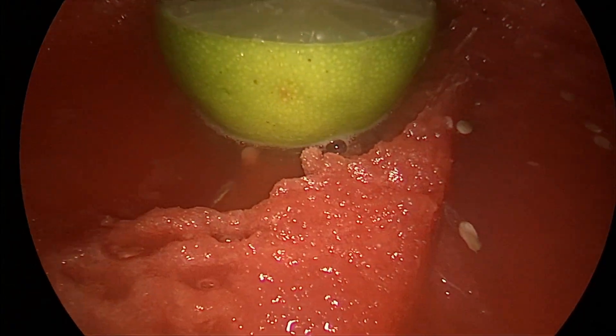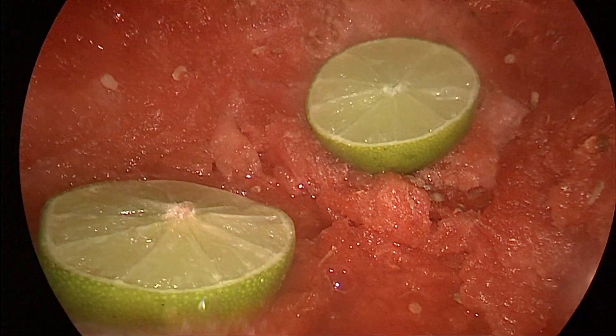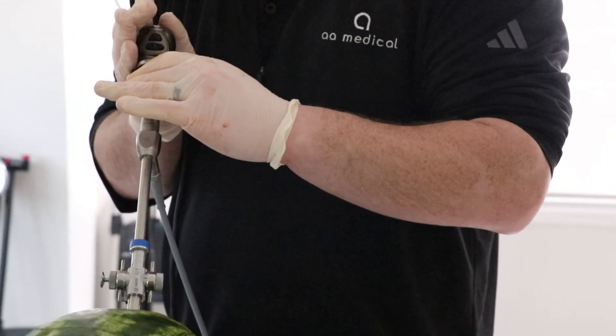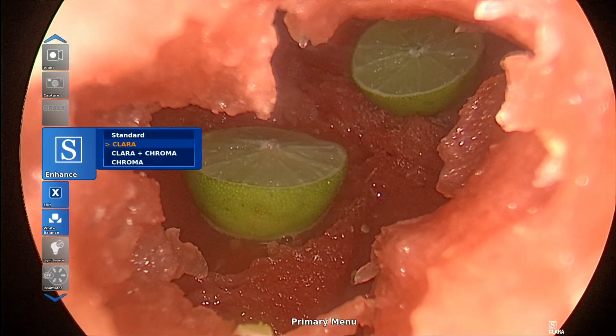The Image One S features Storz's professional image enhancement systems, offering five visualization modes: Clara, Chroma, Spectra AB, and fiber filters. While each mode enhances visualization, diagnosis, and treatment, this blog focuses on Clara and Chroma. Here's a quick overview of the two modes.